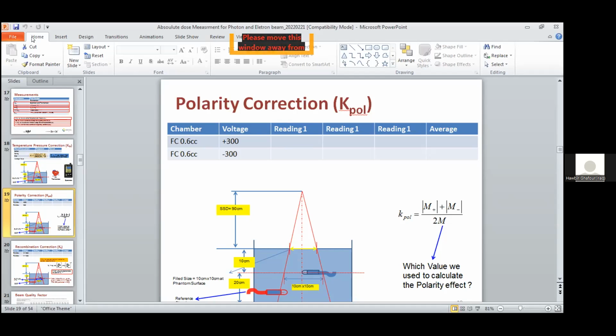like to know, for the reference dosimetry of photon beams with the cylindrical Farmer ionization chamber, should the end of the Farmer chamber be on the axis of the beam, or the middle of the Farmer, because as I see from this slide, the end of the cylindrical ionization chamber is on the central axis of the beam.